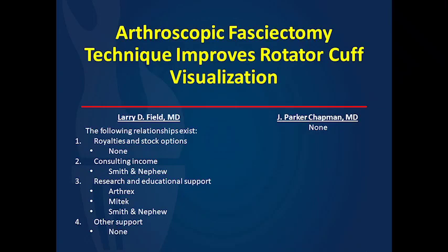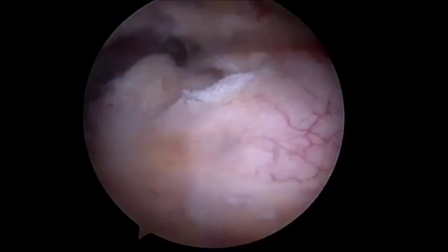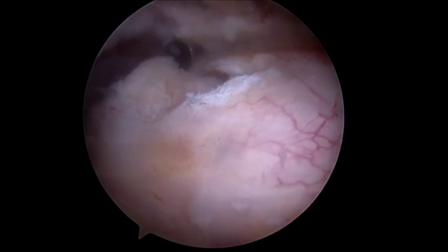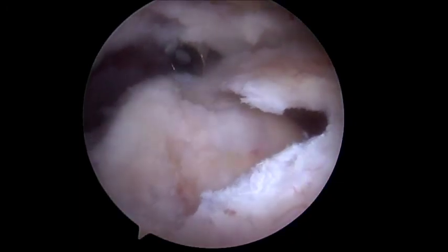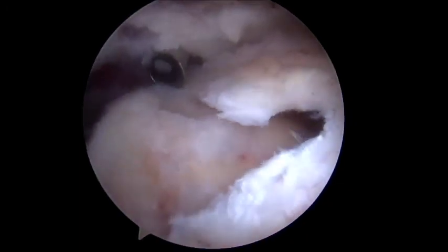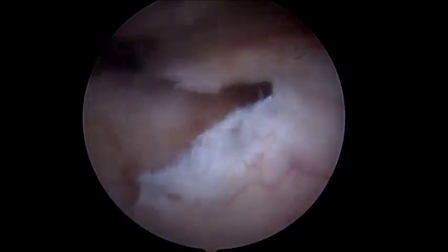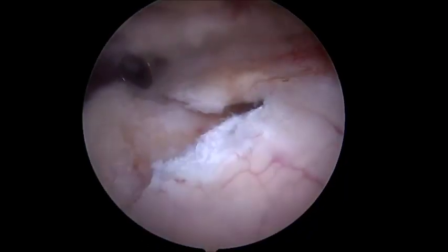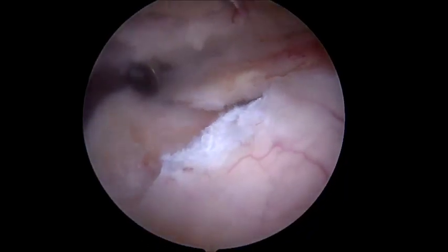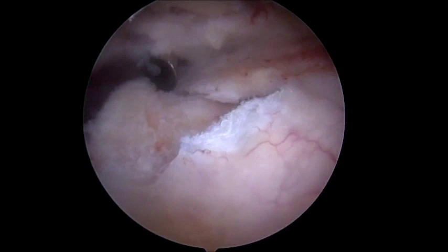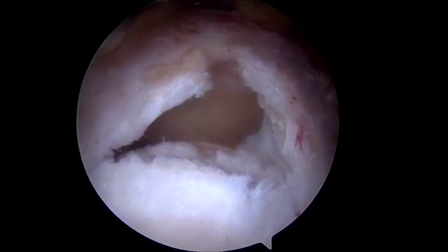This video demonstrates a technique to improve visualization of rotator cuff tears from a lateral viewing perspective. This left shoulder in the beach chair position, viewed from a posterior portal, shows a rotator cuff tear of the supraspinatus. However, there are significant limitations in how much we can appreciate from the posterior portal.